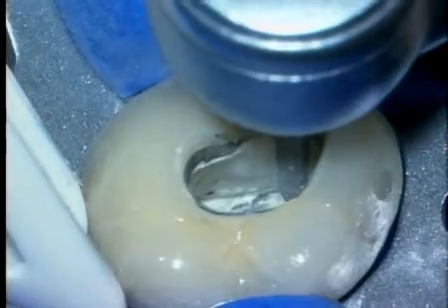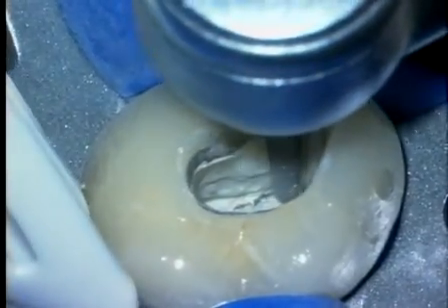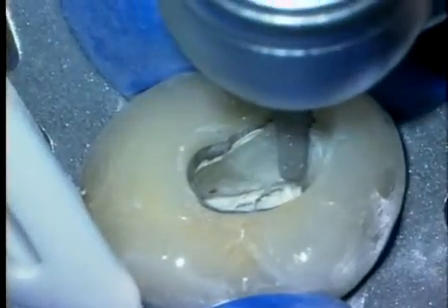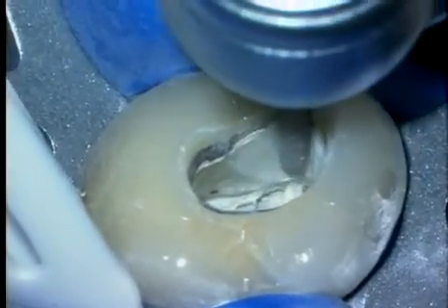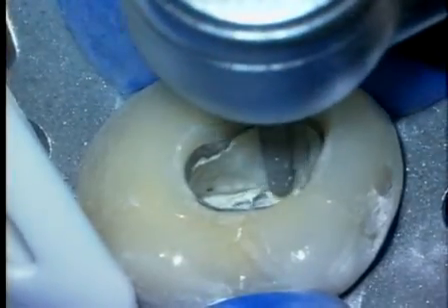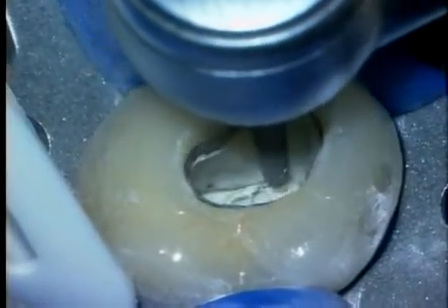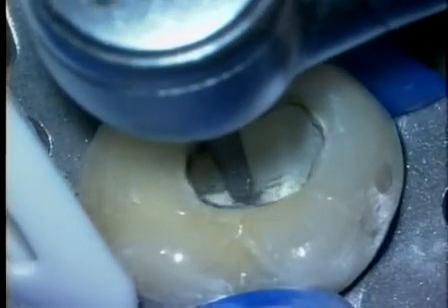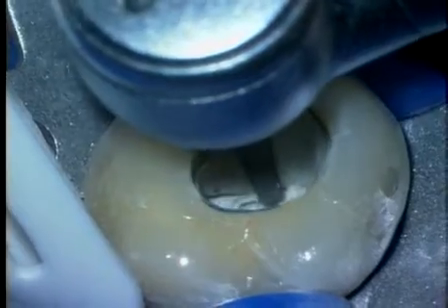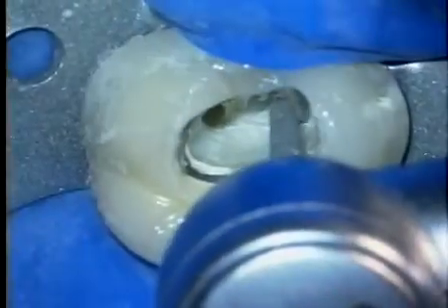Slightly adjust the patient's head so you have an excellent line of sight into the pulp chamber, and importantly, so you can watch just the coronal 2/3 of the diamond work. The tip of your diamond wants to be free as you sweep back and forth on the mesioaxial wall. As you ramp around the line angle from the MB to the buccal, be sure to keep the free end of the diamond off the pulpal floor.